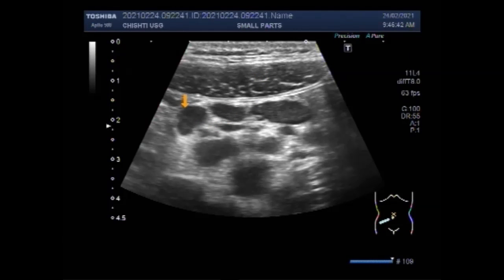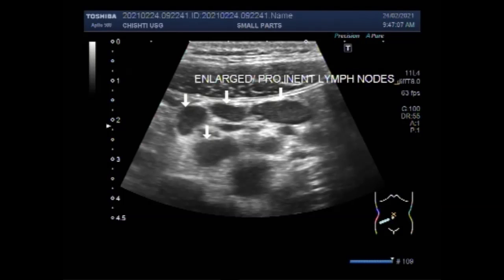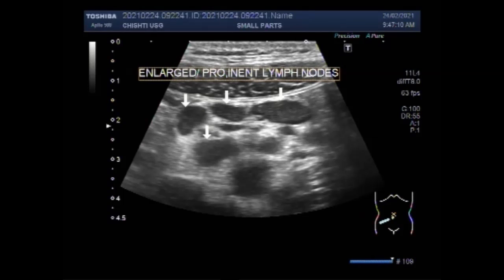You can see the largest lymph node measures more than 1 cm. The sonogram of normal mesenteric lymph nodes shows they are ovoid with a prominent fatty hilum. In this case, the short axis diameter is more than 1 cm — more than 10 mm — but normally they should be less than 5 mm. A thickened ileum and cecum and a normal appendix are depicted adjacent to the enlarged lymph nodes in a patient with mesenteric lymphadenitis and terminal ileocolitis.